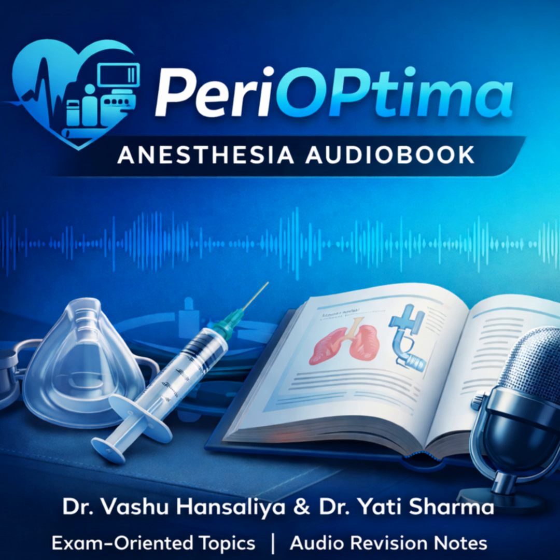So to summarize for the exam, scavenging protects the staff from things like immune-mediated halothane hepatitis, and the interface protects the patient from barotrauma or lung collapse. That's the perfect summary. And in the long answer, you just briefly mention the types: active, which uses vacuum, and passive, which uses the building's ventilation.